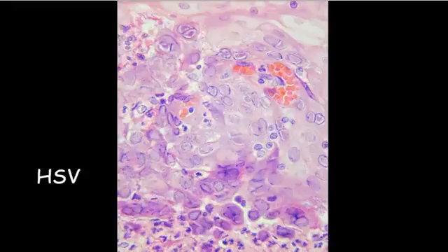And here's a high power view. This is a Hollande's fixed specimen. My first year here at Hopkins, we fixed everything in Hollande's, which gave you exquisite cytologic detail, or as my colleague Henry Appelman says, makes every cell look malignant. But we quickly realized that we couldn't get any DNA out of these samples. So of course we switched to formalin the next year and lost our exquisite cytologic detail.